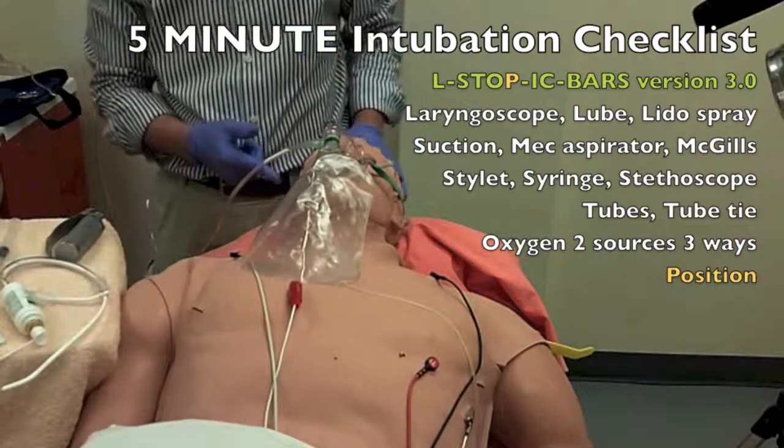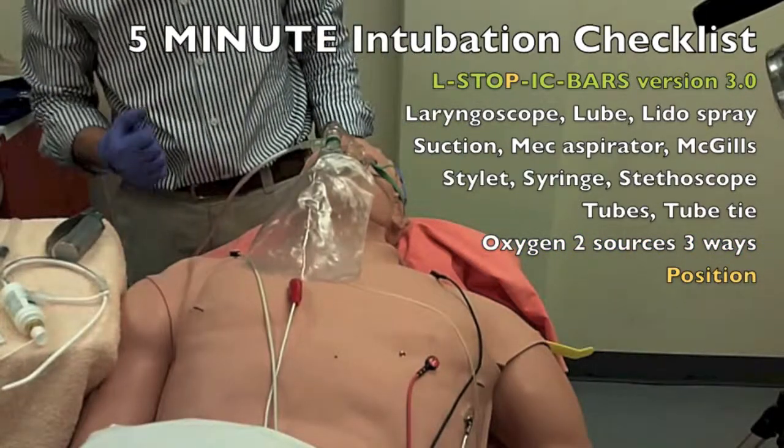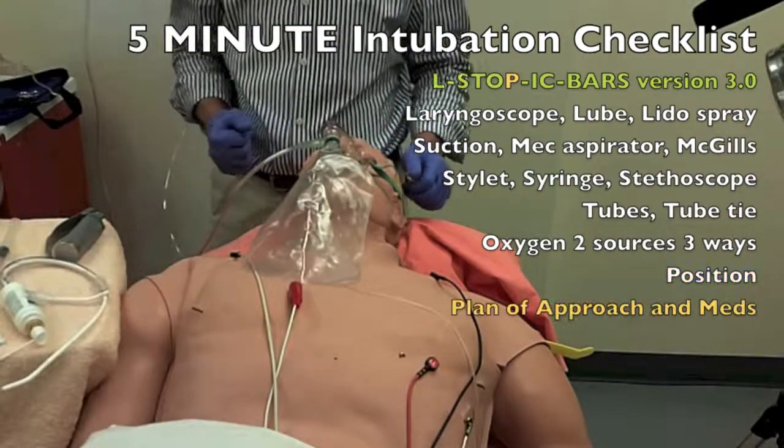Okay, we've got the patient positioned the way you like right now. Position: ear to sternal notch, face plane parallel to the ceiling, head of the bed 30 degrees. We don't need reverse Trendelenburg. Check. And what's our plan?